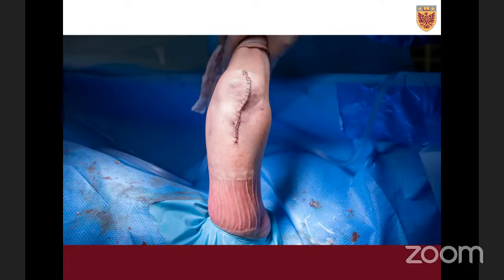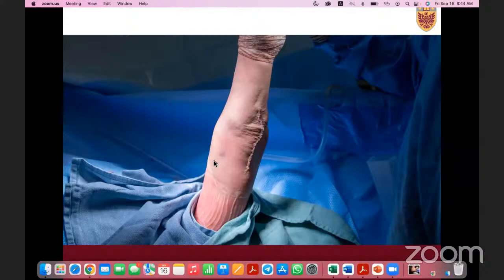The nice thing is that if you tag this with non-absorbable sutures, when you go back for any revision you literally just go through those sutures and everything — including the ulnar nerve — comes off together. So the ulnar nerve is not at risk in revision surgeries; you don't need to spend an hour looking for and dissecting the nerve off from scar tissue. This makes it a very good approach for revisions.